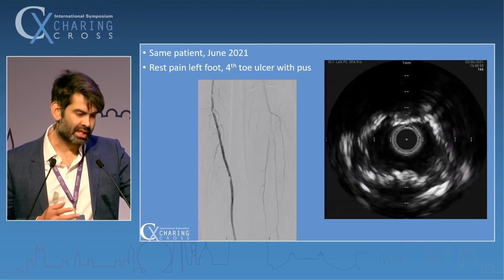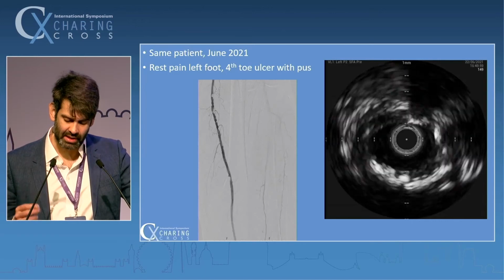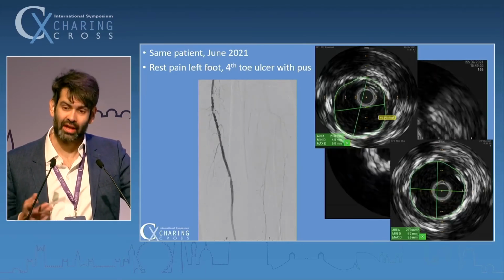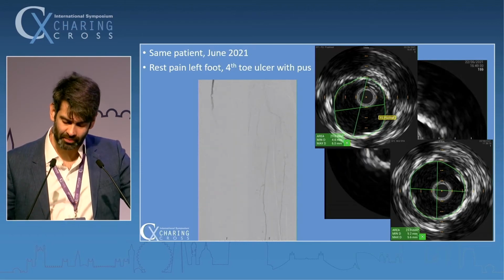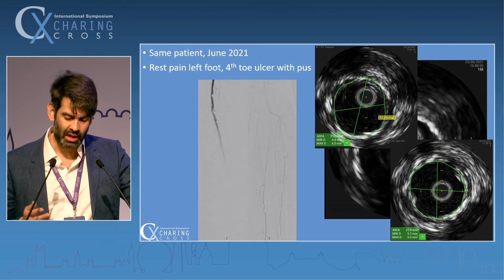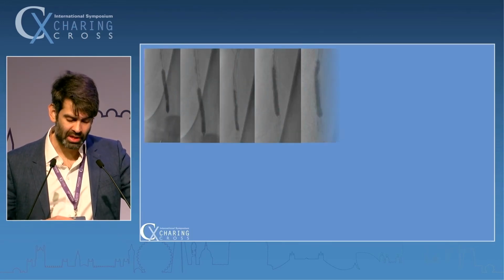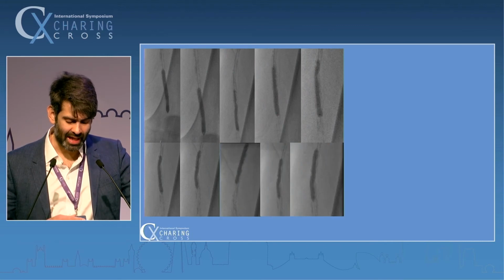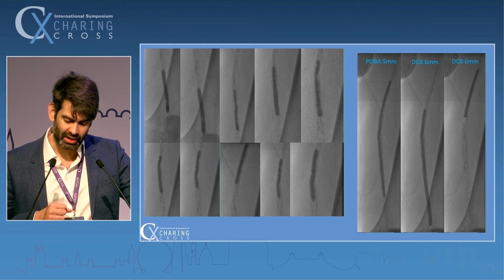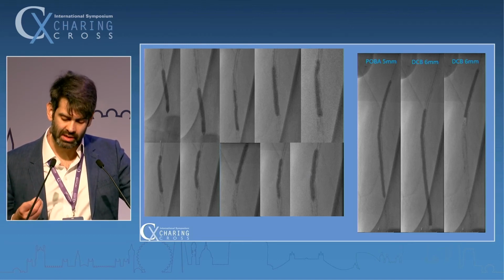You can see on the intravascular ultrasound pictures how calcified this disease is, and you can understand how this is going to respond to plain balloon angioplasty, and we know how the atherectomy story ends from the previous procedure. So we used the intravascular ultrasound to size accurately for the procedure. As has been mentioned before, it's important to oversize the balloon correctly to get good wall apposition. You can see the Shockwave balloon expanding without any additional inflation, which means that the Shockwave pulses are breaking the calcium and changing the compliance of the vessel wall.